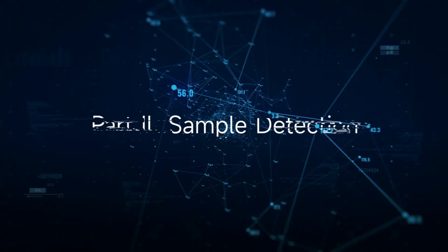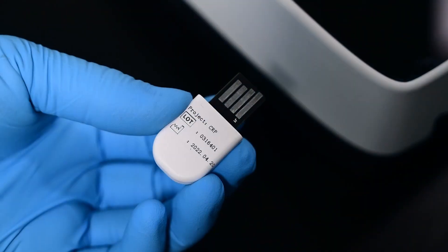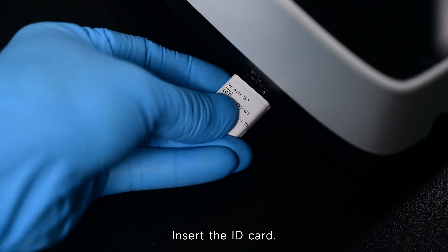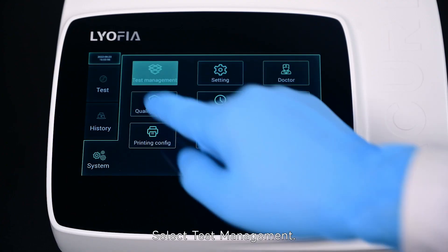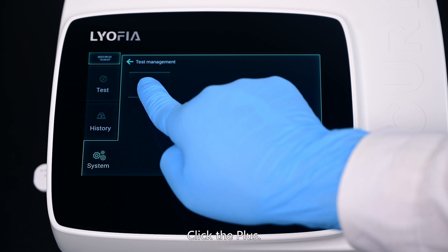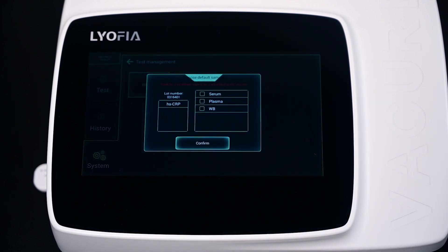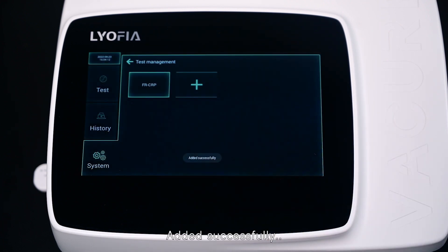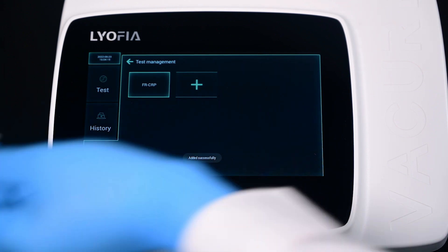Part 2: Sample Detection. Insert the ID card. Select Test Management and click the plus button. Click Confirm. Added successfully. Remove the ID card.